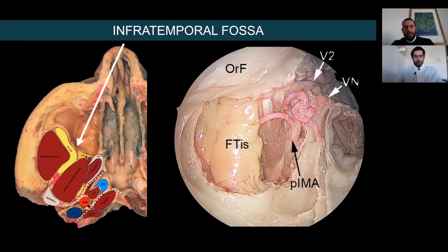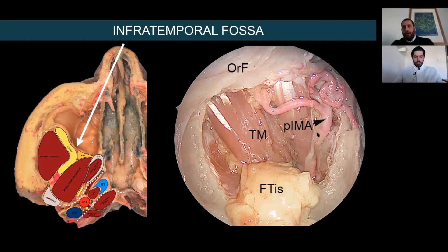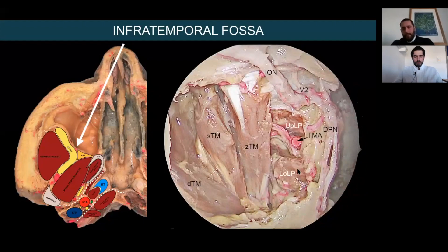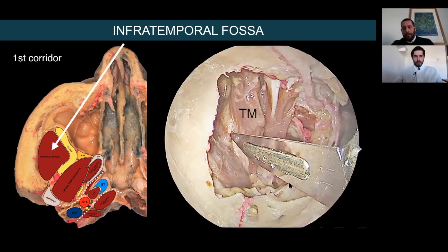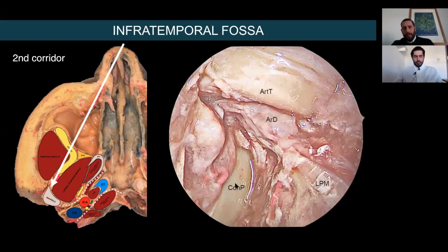Now we go toward the infratemporal fossa. This is the maxillary artery and the fat in the infratemporal fossa. When you remove the fat, you can identify the bellies of the temporal muscle in one direction, and more medially the horizontal bellies of the lateral pterygoid muscle — inferior belly, superior belly. We can now identify different corridors: if you go between the bellies of the temporal muscle, you can reach the coronoid process of the mandible. If you go between the temporal muscle and the pterygoid muscle in this fissure and proceed forward, you identify the condylar process of the mandible — this is the articular disc and the TMJ.